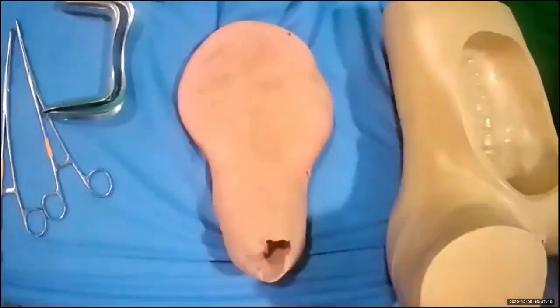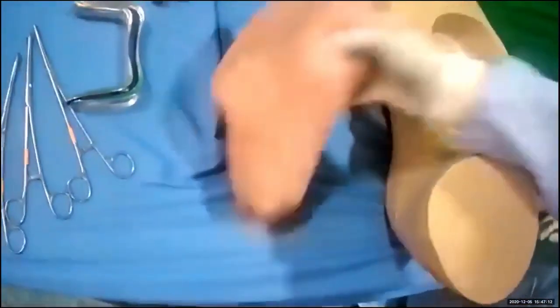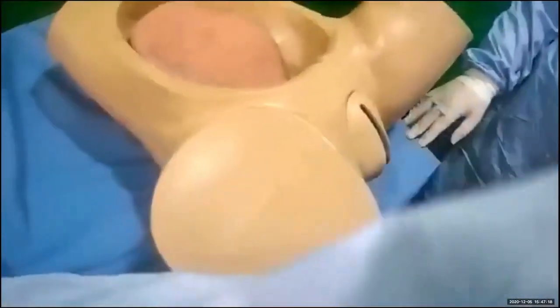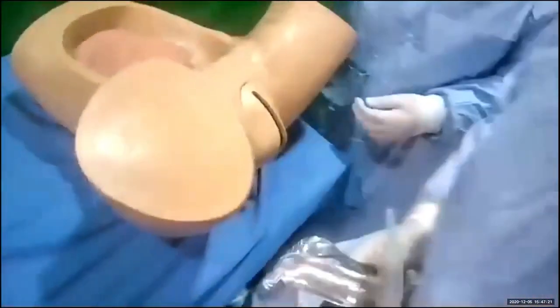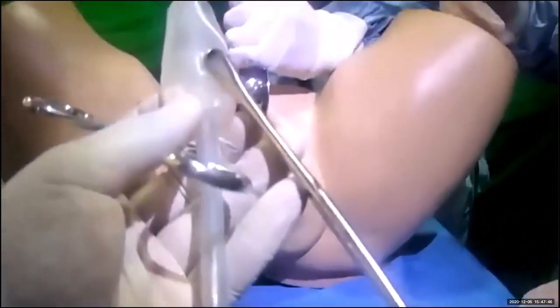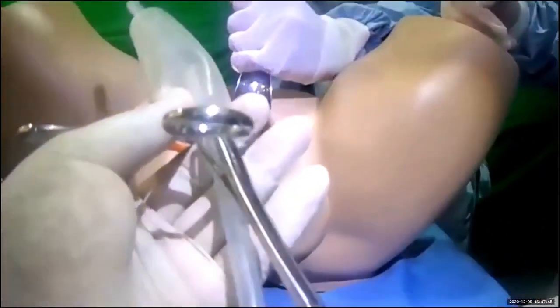I am now going to demonstrate a Bakri balloon insertion. The principles are the same: you need good assistance, you need SIMS forceps, and you need good lighting. Under direct vision, use a sponge forceps to grab the anterior lip of the cervix. Use another sponge forceps to grab the Bakri balloon — but do not grab it at the balloon, as this may puncture it. Grab it just below the balloon.